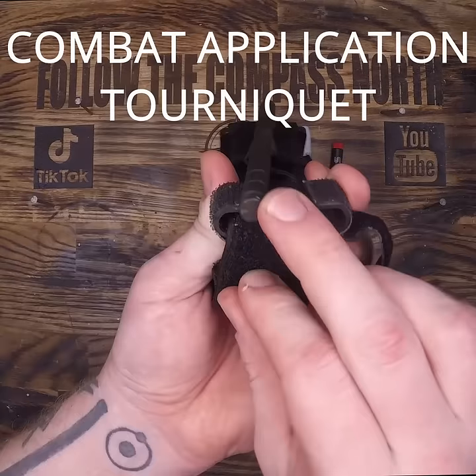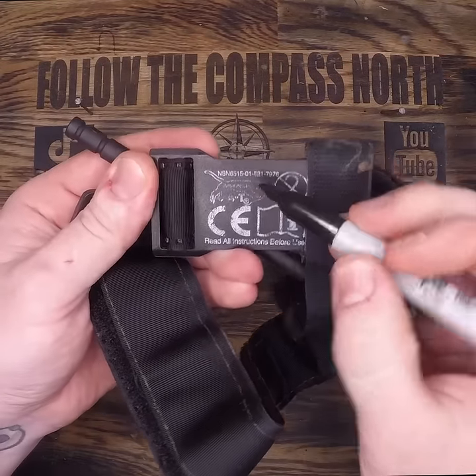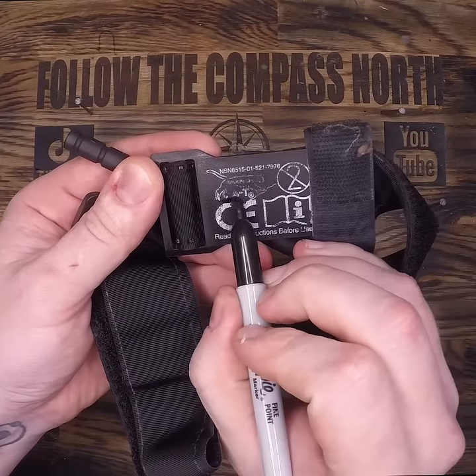How to properly use a CAT. You can tell it's a CAT because of a longer bar, and also on the back it'll have a picture of a cougar and the letters C-A-T — when they're not worn out like mine.